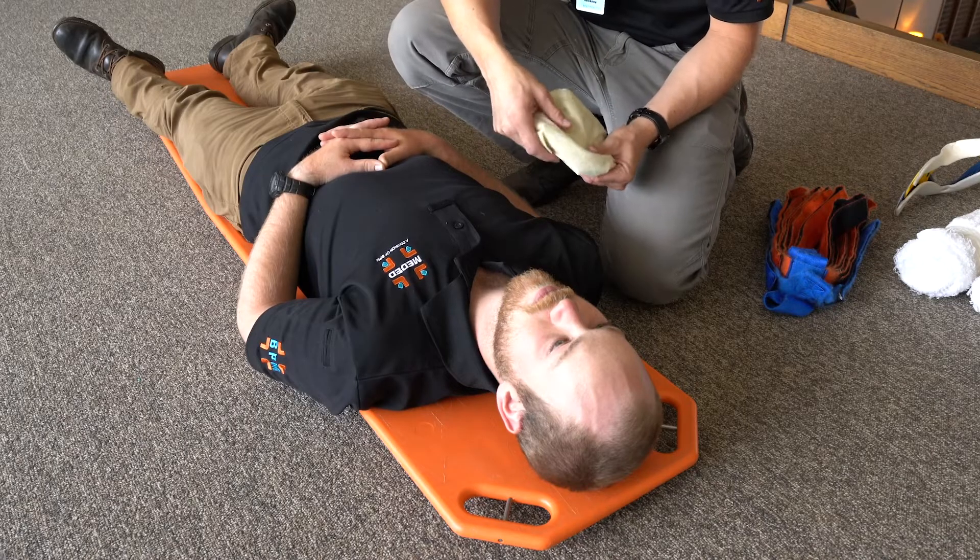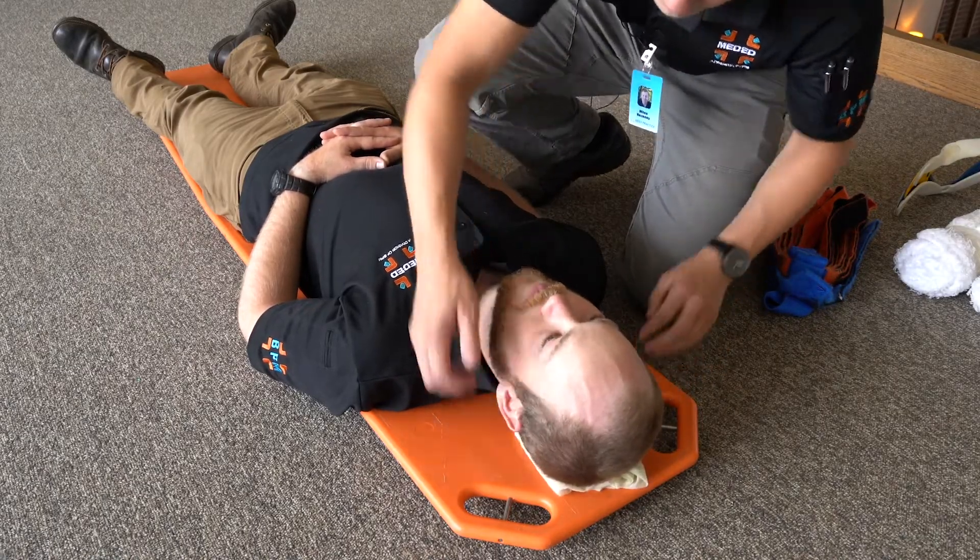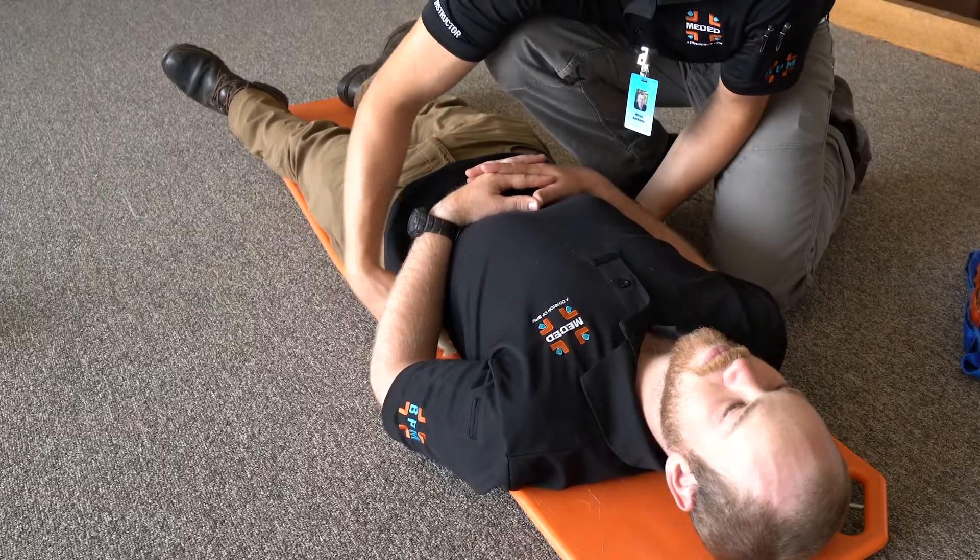Then place an appropriately sized cervical collar to help stabilize the patient's neck. Position the immobilization device next to the patient and direct movement of the patient onto the immobilization device without compromising the integrity of the spine, moving the patient's whole body as a unit. Assess and apply padding as necessary to any void underneath the patient's back or knees. A foam pad or cravats can be used to pad behind the patient's head and to fill any voids underneath the patient.